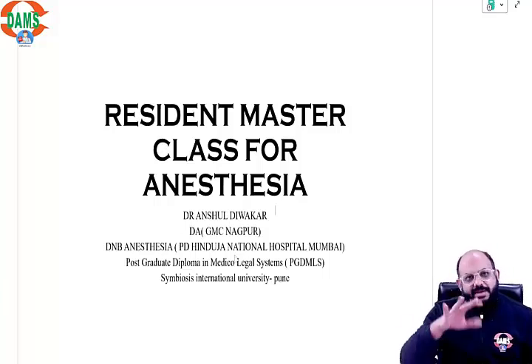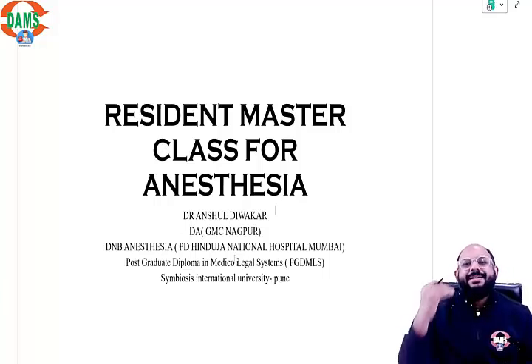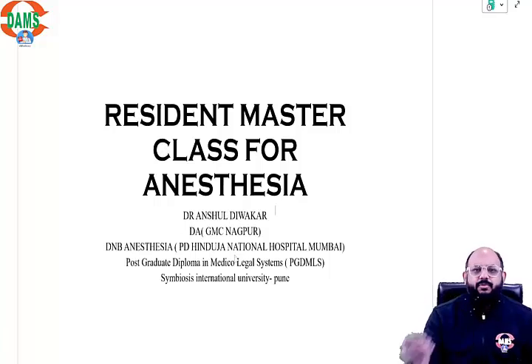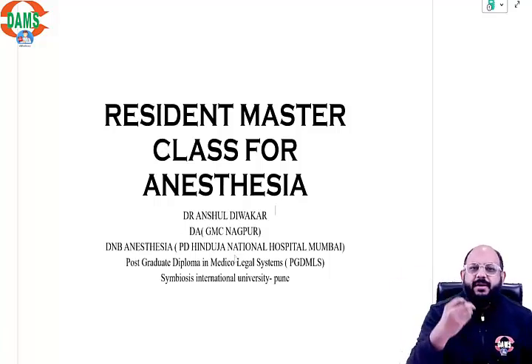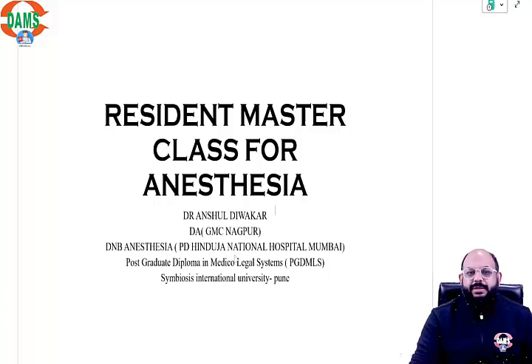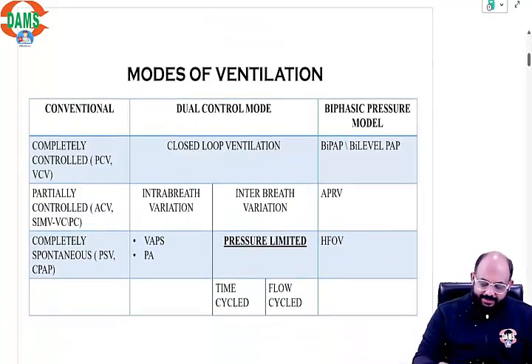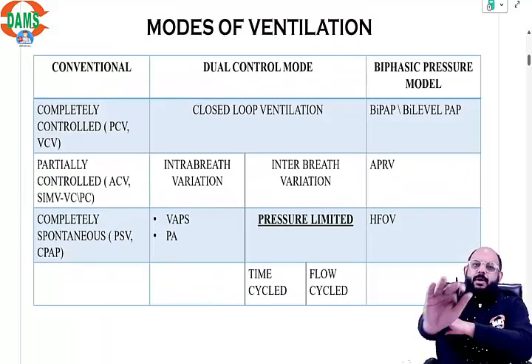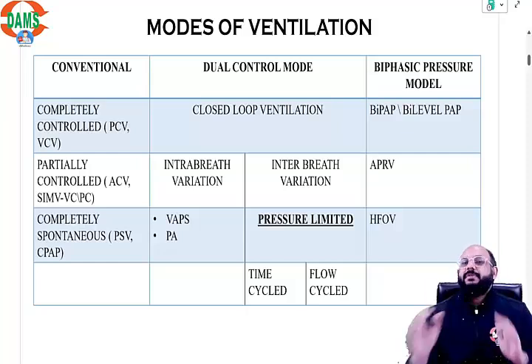But it forms a very important part of the recent advances in the exams that we come across. So in theory and sometimes in practical, they might just pop up a question, okay, do you know NAVA, or do you know APRV, or do you know inverse ratio ventilation and stuff like that. So we are going to discuss them, and I have divided them into very amazing ways. I have just tried to compare similar modes of ventilation with each other.